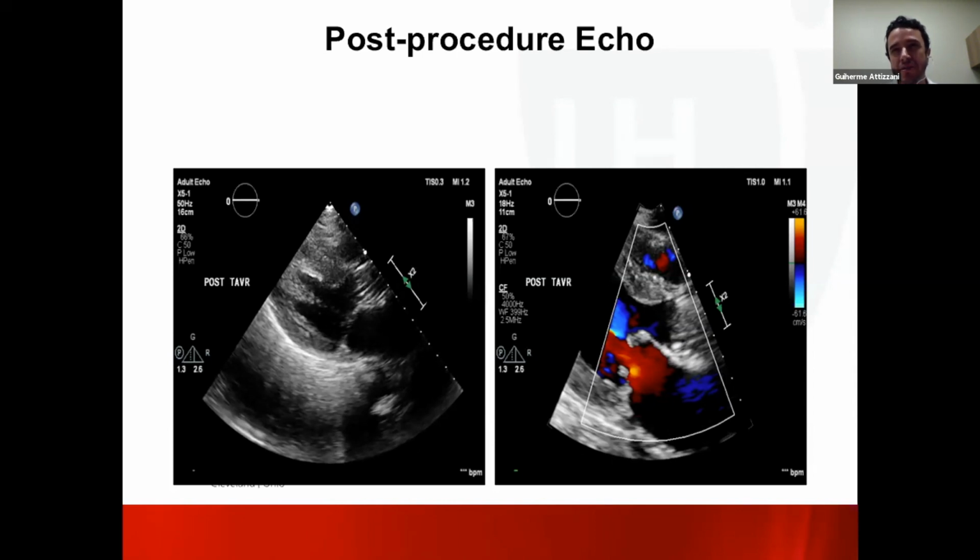We are, in addition, Steve, one thing, we predilate, not only bicuspid, but in general, we predilate more often than the number in the US, as you know, of predilatation is around 30%. We predilate around 60% of our valves, but we rarely post-dilate. We post-dilate less than 5% of our valves, and the number in the US is around 30-35%. Because I implant high, I tend to predilate more to avoid post-dilatation. Of course, in bicuspid, this mathematics doesn't work all the time, but we've been successful, but we're cognizant of the higher risk of migration north.